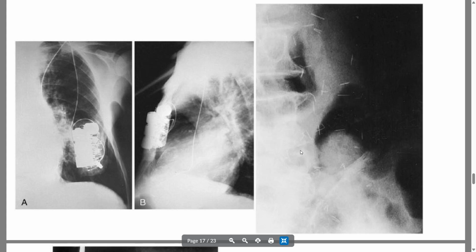On the right, again, we have a partial lumbar spine. This is an iliac wing, and we have some vertebral bodies here. But all of these little tiny radiopacities, if we're thinking things that are dense, we think of things that are metal. Could this be scratches? Absolutely. This patient has a bunch of embedded acupuncture needles, either that weren't taken out accidentally over time, or they're done for a specific procedure, I'm not sure.